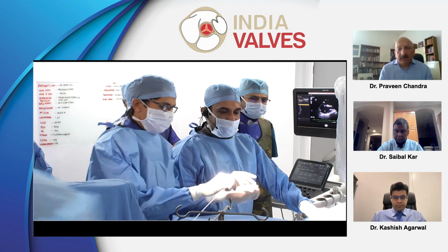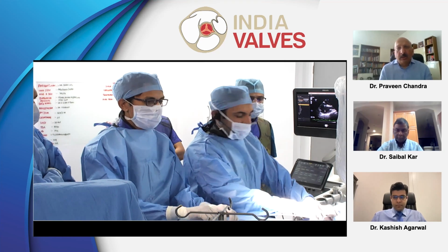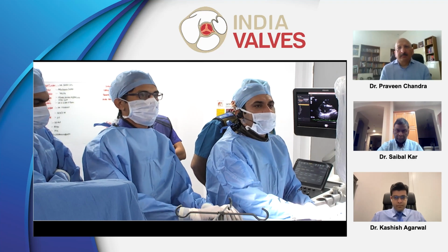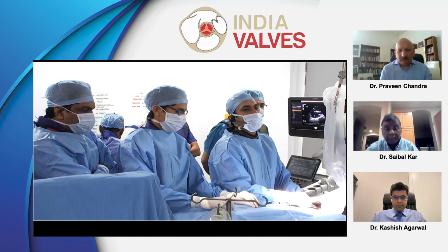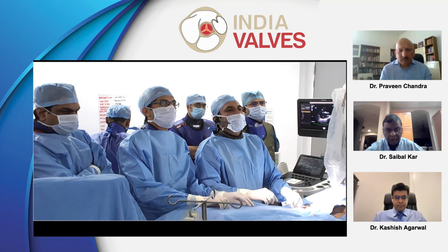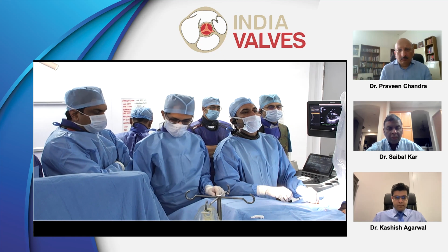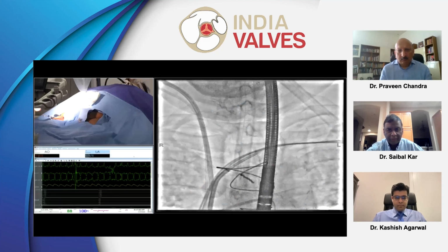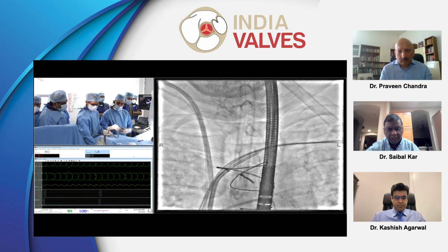So let me take the first comment from Dr. Saibal Kar in terms of case selection and the selection of clip. So I think it's an excellent case to be done. First of all, he's definitely high risk. He's got previous bypass surgery, moderate renal dysfunction, and LV dysfunction with DMR, which is actually really bad because he's got a flail P2 and LV dysfunction, 35-40%. So putting it all together, this patient is very high risk for open heart surgery.